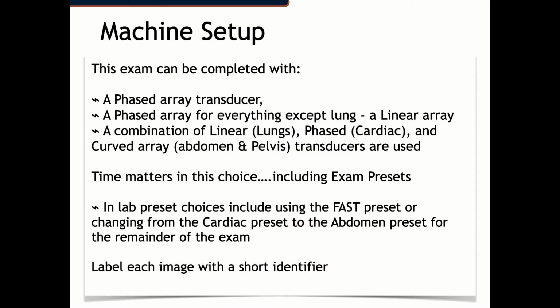So we're going to use a phased array transducer, since that is the universally useful transducer. It is potentially possible for you to change your exam as you scan, but it isn't preferable. This is an exam that is going to be done when patients are often unstable, and any change you make is going to eat up valuable diagnostic time.